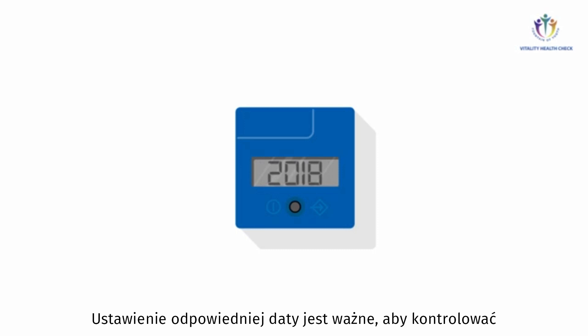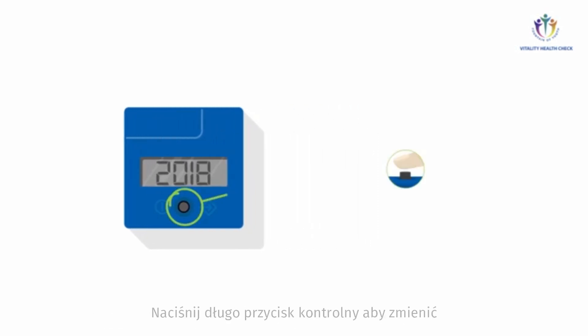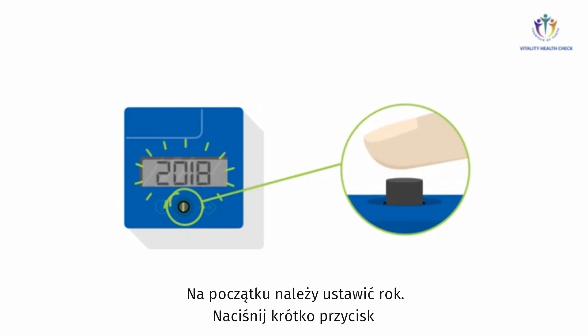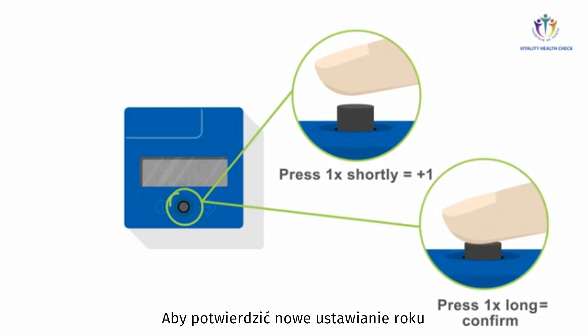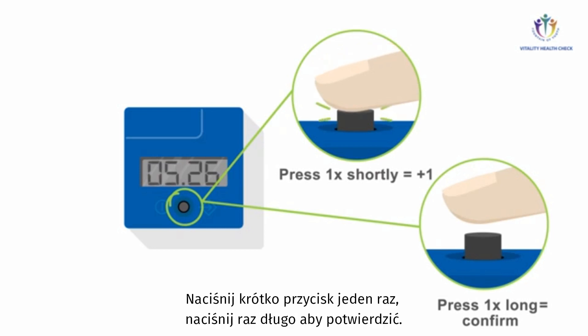Accurate date setting is important in order to control whether the test cassette has reached its expiration date. Press the control button long to change the current date settings. First, you have to set the year. Press the button shortly to increase the number of the year by one. To confirm the new setting of the year, press the button long. You may change the month and day settings by following the same principle: press short to change plus one, press long to confirm.